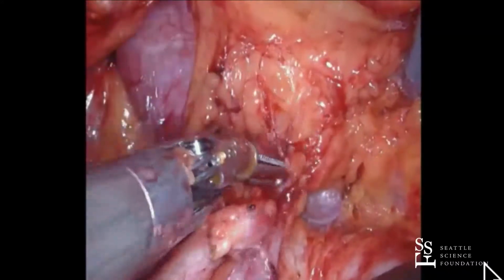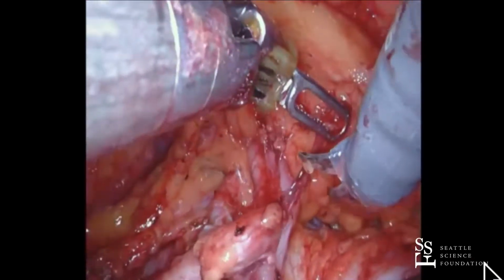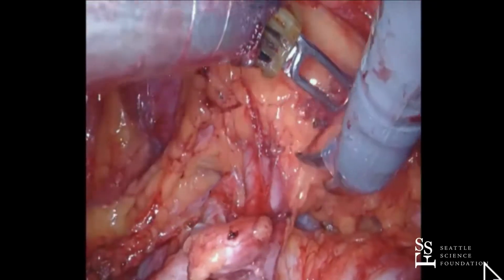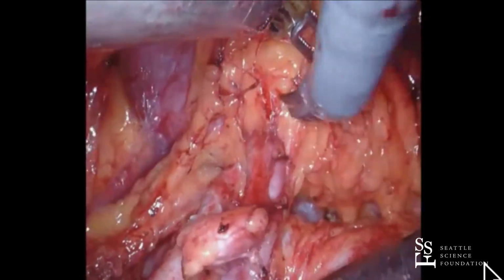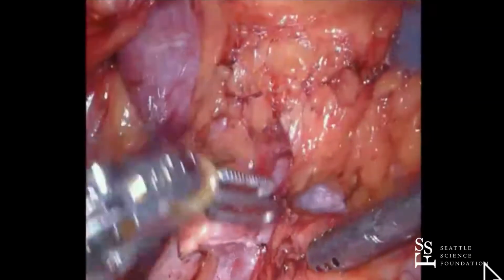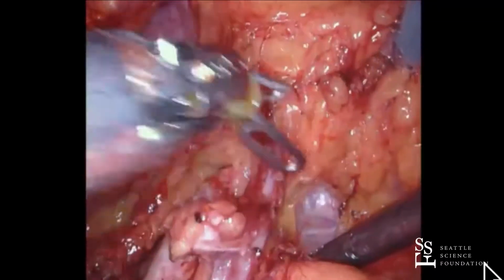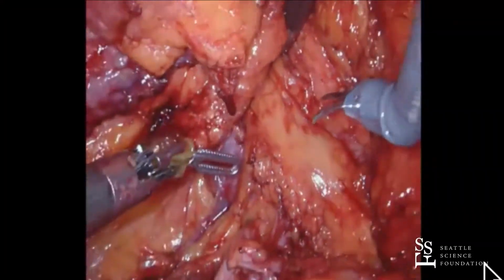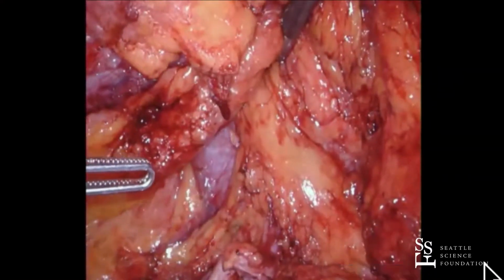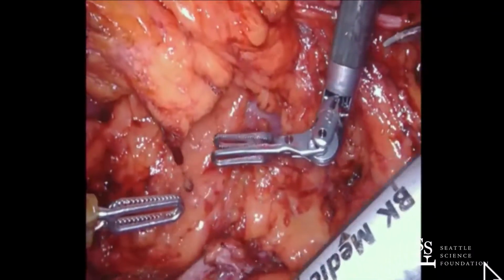I'm just going to see this. There's a vein going along here, kind of a weird posterior vein branch. I think you should just ignore it. It's kind of weird, but we know what it is, so I'm okay with it. Okay. All right, so let's bring in ultrasound, Brando. How much fluid, Mimi? 20. Go ahead and give 20 Lasix, please.